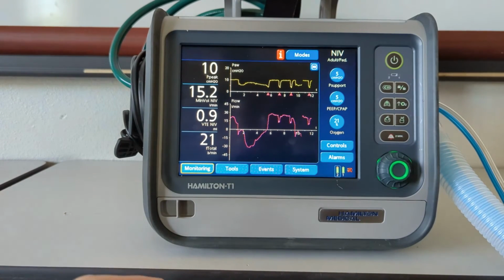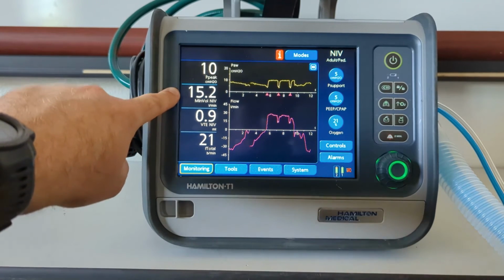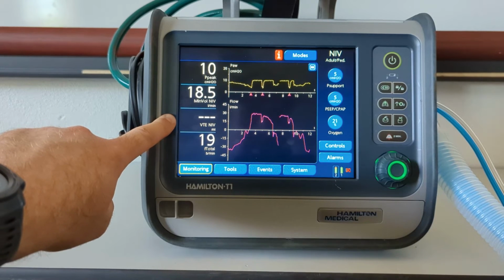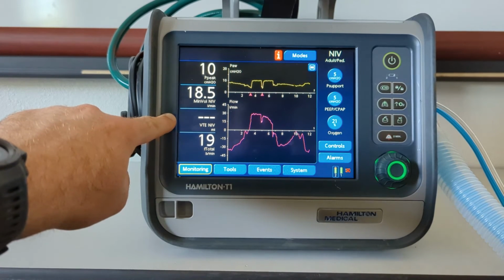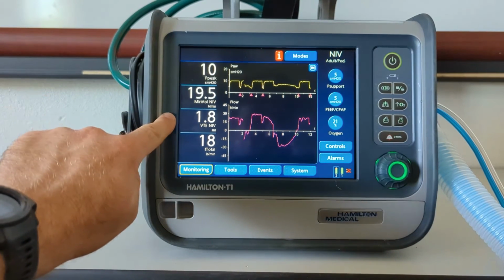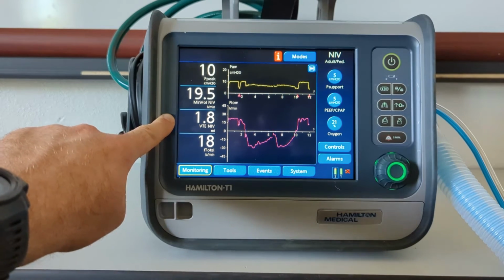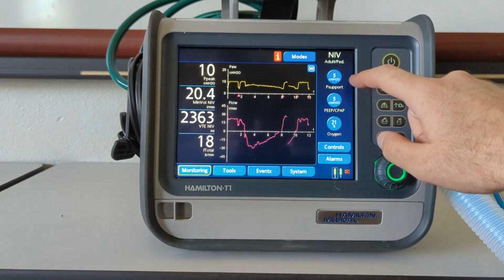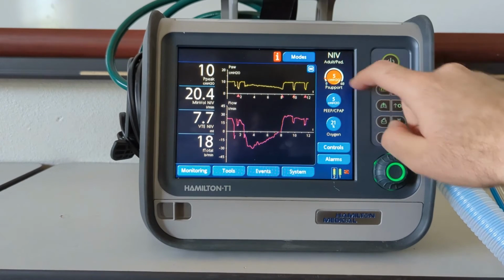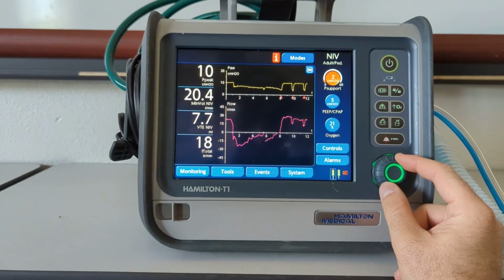What we're really trying to do is match our calculated minute volume from the ventilator triangle and the calculated expired tidal volume from the ventilator triangle. The key to this is, since we're not controlling the rate, you need to adjust the tidal volume to that number you calculated, the 7 ml per kg ideal body weight. That is done by adjusting the top number, the pressure support. If it's too low, you need to increase this number. If it's too high, you need to decrease this number.